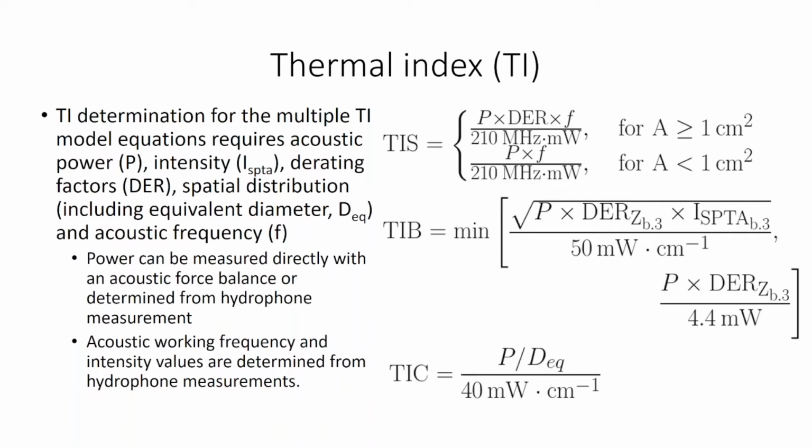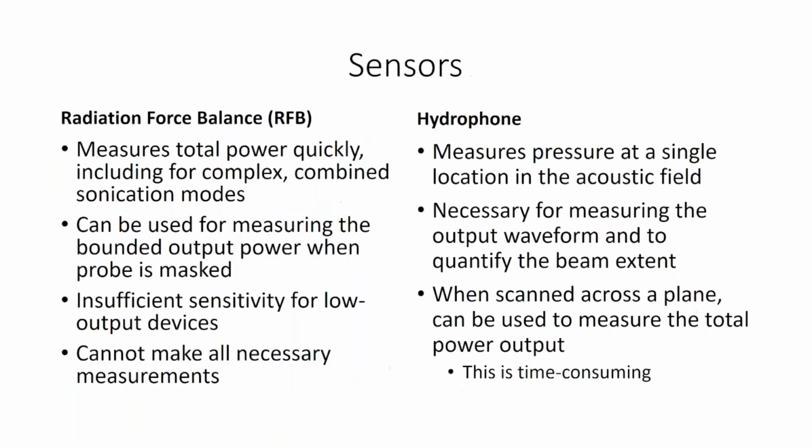It's worth noting that the power can be measured directly with an acoustic force balance or radiation force balance, or it can be determined from a hydrophone measurement. Acoustic working frequency and intensity values are necessarily determined from hydrophone measurements.